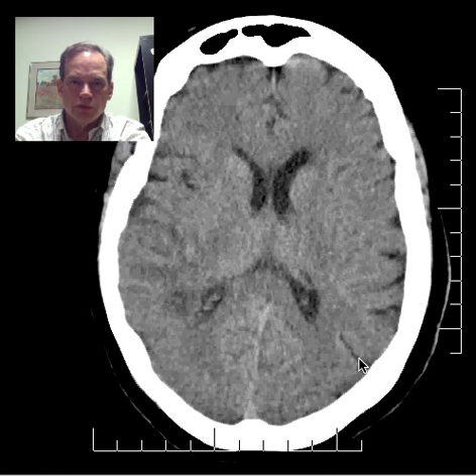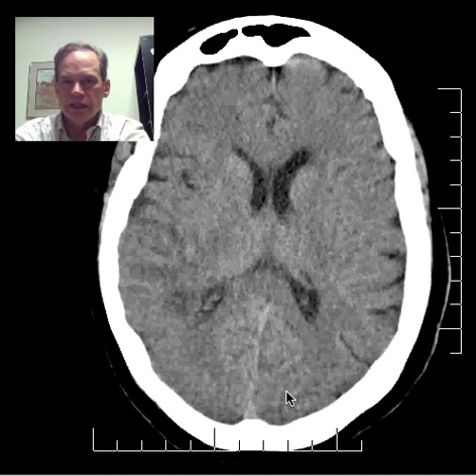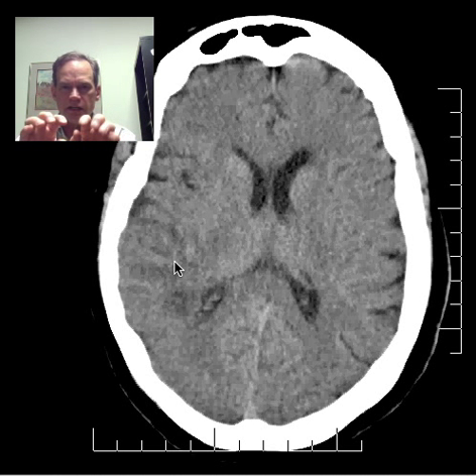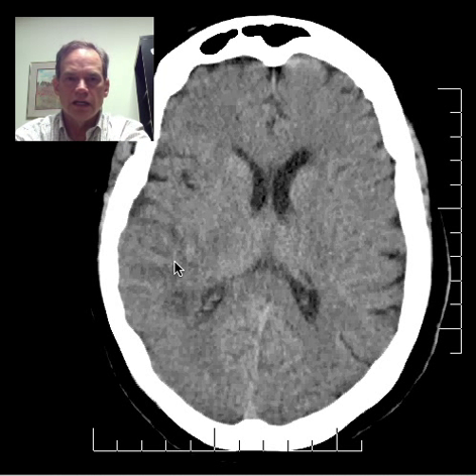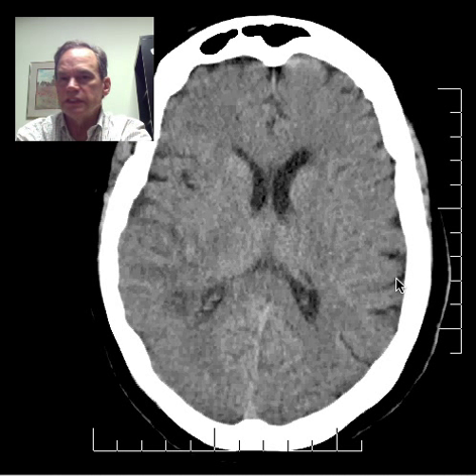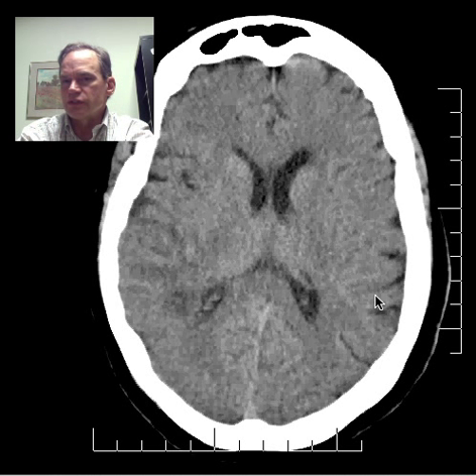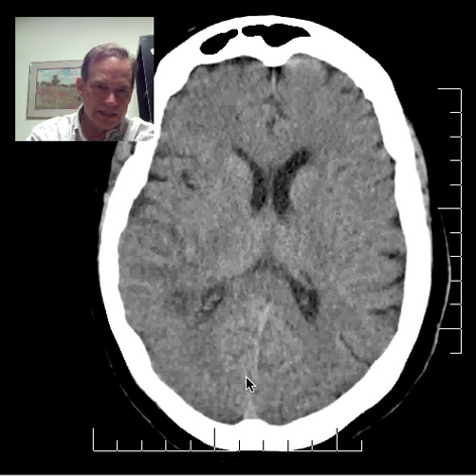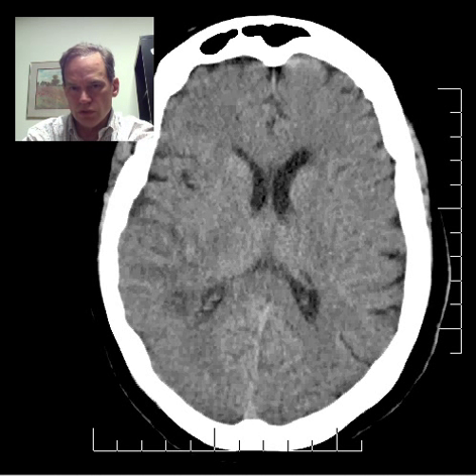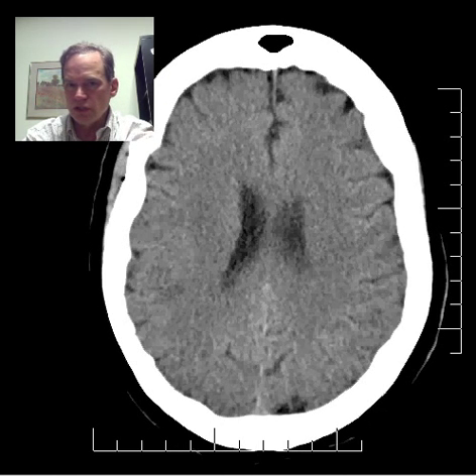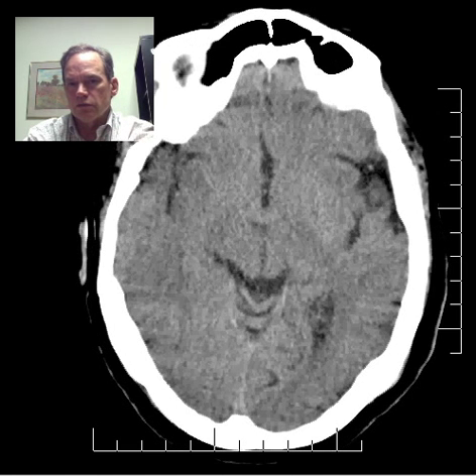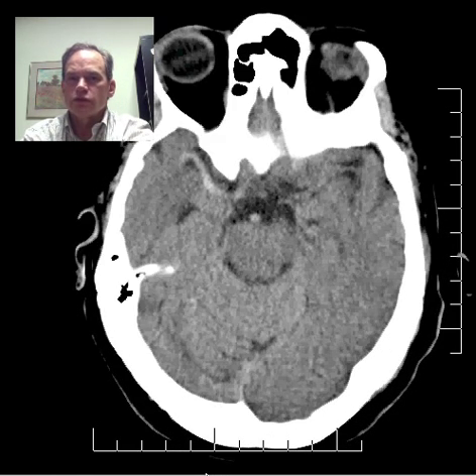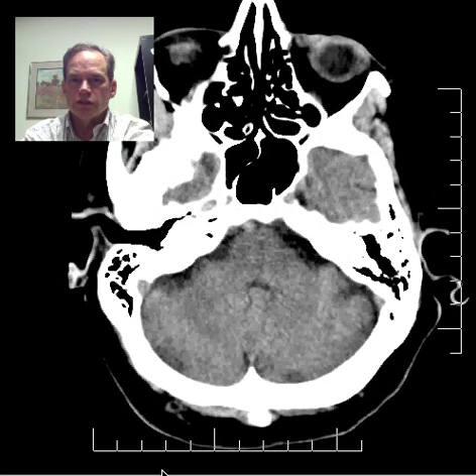Going up higher, you see quite a few sulci on this side, but you've lost most of them on the other side. That's mass effect — those normal cortical folds have become edematous, they extend and thicken, and that effaces the CSF-filled sulci. Sulcus is singular, sulci is plural. So here you have a right middle cerebral artery territory infarct. It may also be encroaching on the posterior cerebral artery territory — either an anatomic variant or the PCA is also compromised.